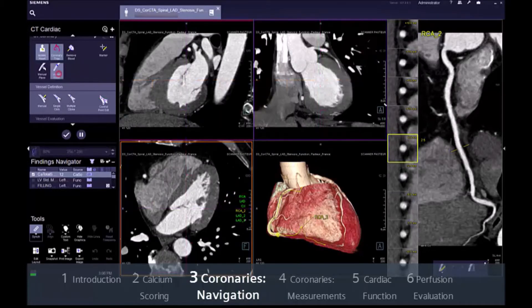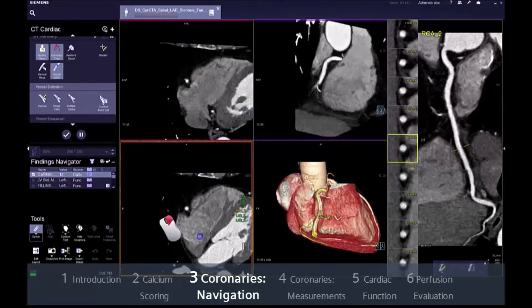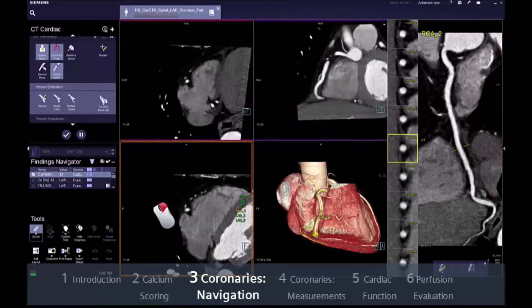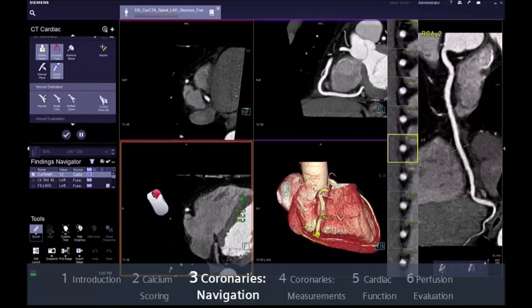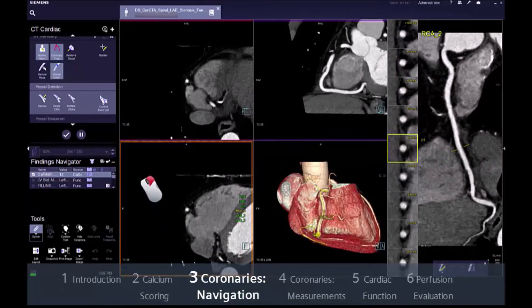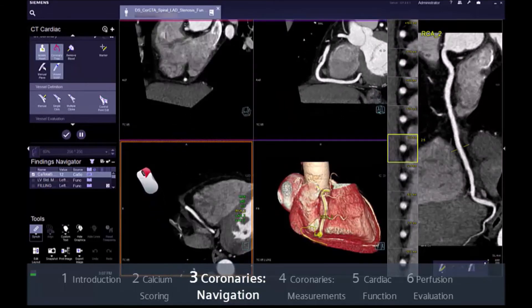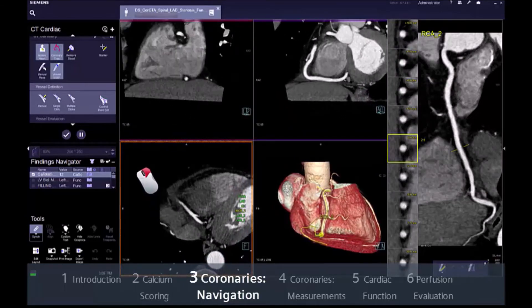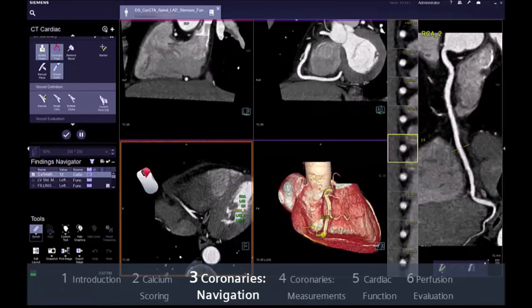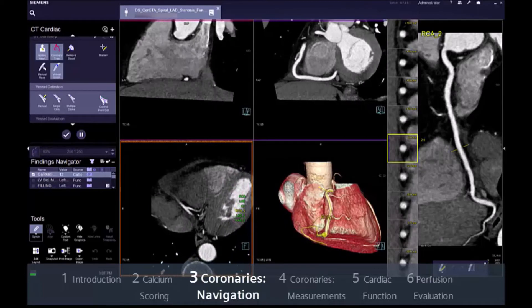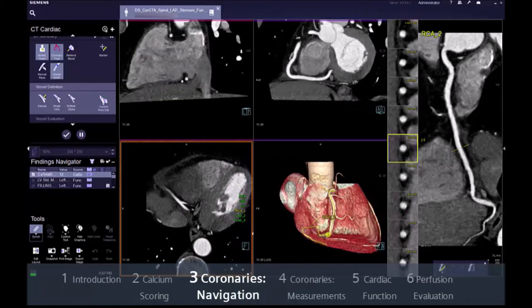Just select the tool, left click on the vessel you want to follow and drag the right mouse button to surf. The segments will update to display an orthogonal and longitudinal view of the corresponding vessel.